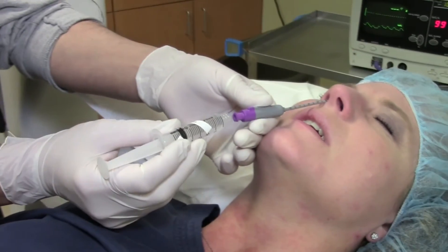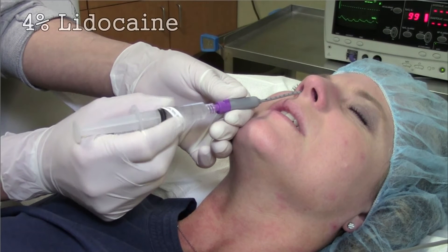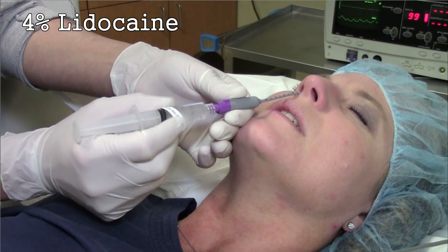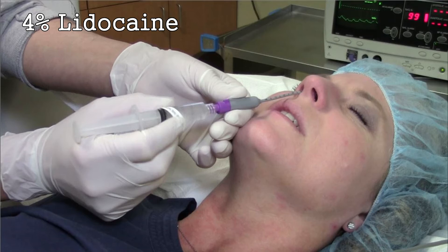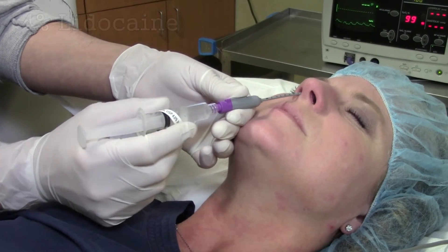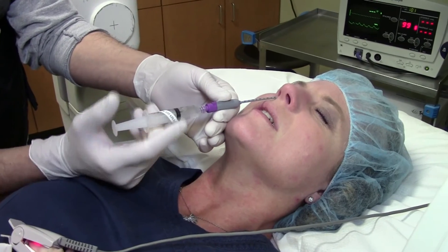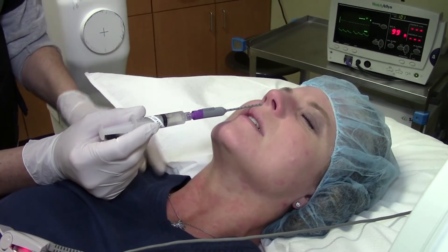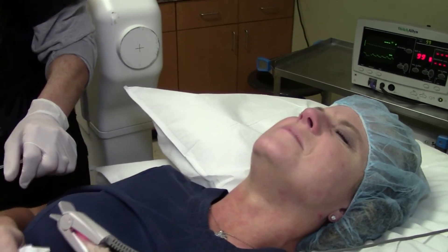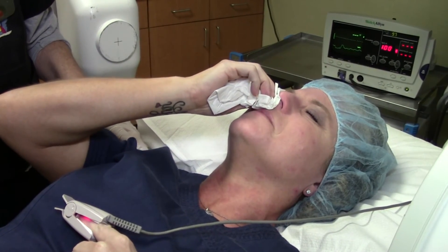I am now going to connect the syringe that includes 4% lidocaine and 3 milligrams of betamethasone, and I am going to administer 2 mLs of the injectate. We will repeat the same sequence on the other side, performing this treatment bilaterally.